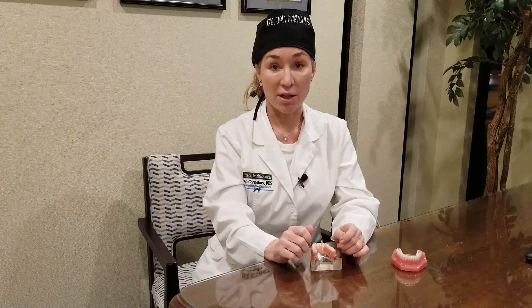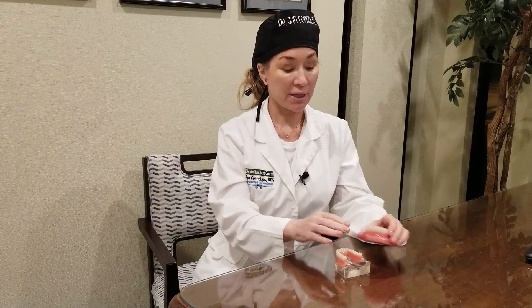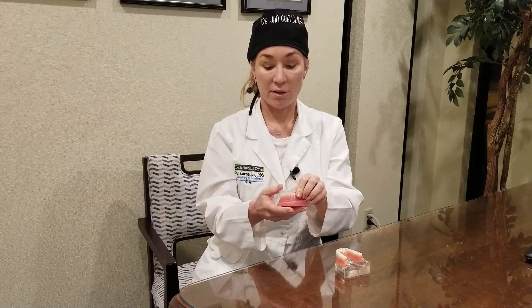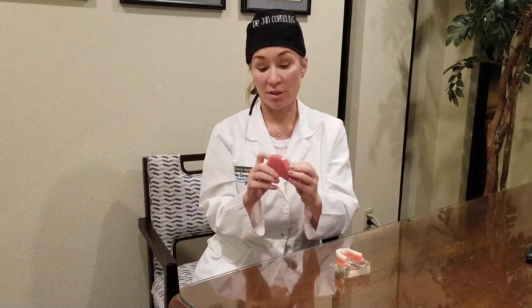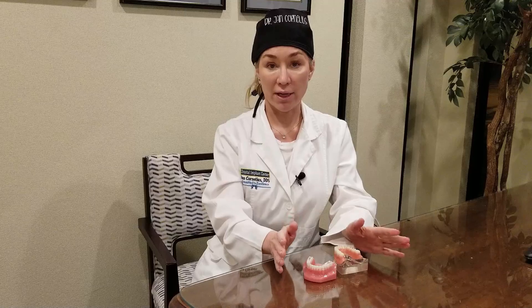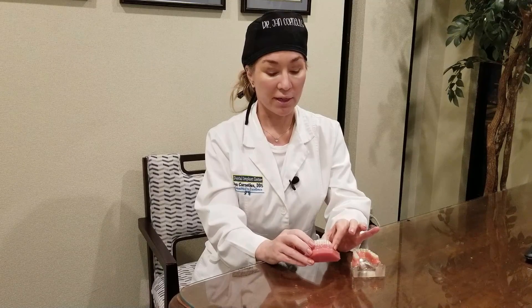The implants are placed in rock-solid bone. Different temporaries can be made — if you have existing teeth, a temporary can be made that looks like this and just snaps to your teeth, like Invisalign braces. It just snaps over it and looks pretty much just like teeth. It hovers over any bone grafting, which is really nice, and it's quick.